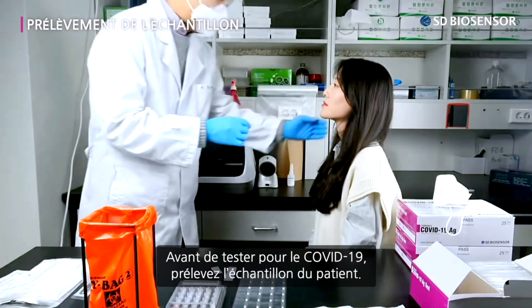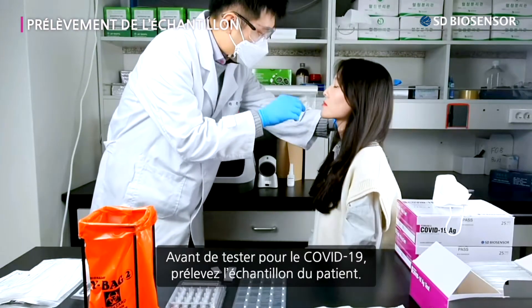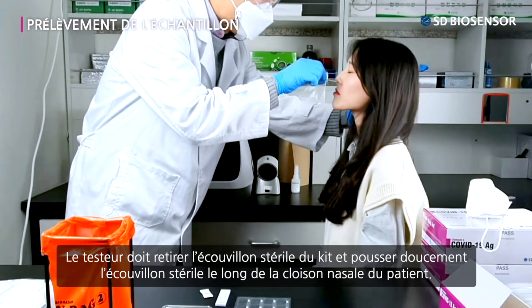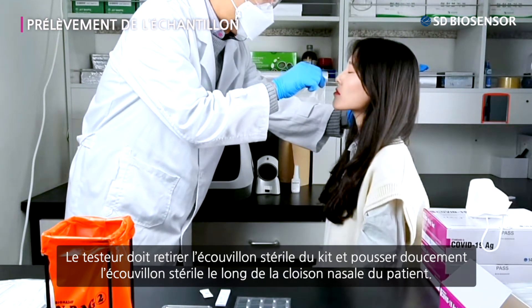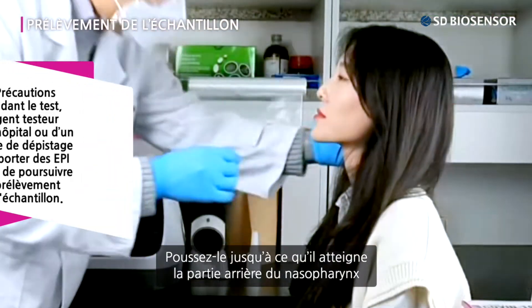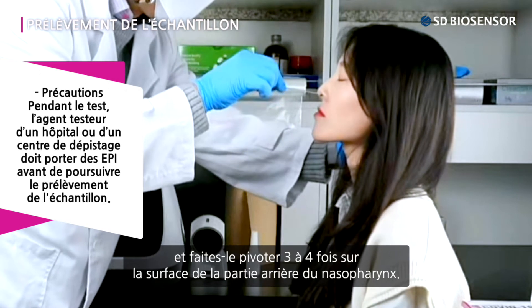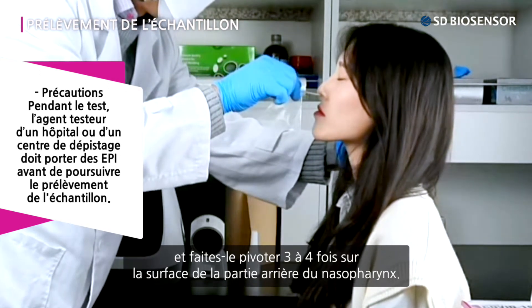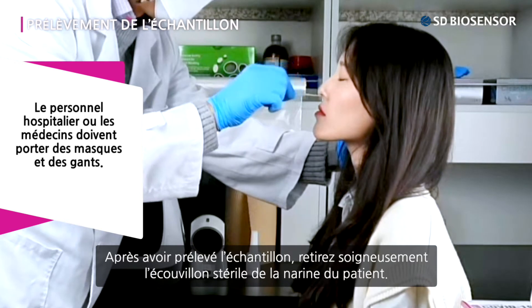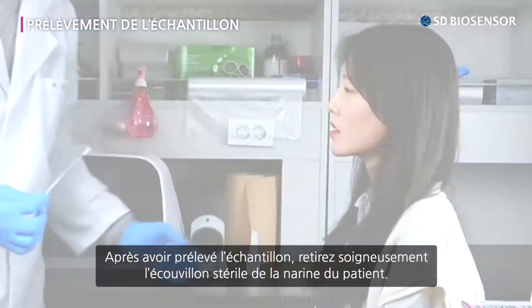Before COVID-19 testing, collect the patient's specimen. The tester should take out the sterile swab from the kit and gently push the sterile swab along the patient's nasal septum. Push it until it reaches the back part of the nasopharynx and rotate it three to four times at the surface of the back part of the nasopharynx. After collecting the specimen, carefully take out the sterile swab from the patient's nostrils.